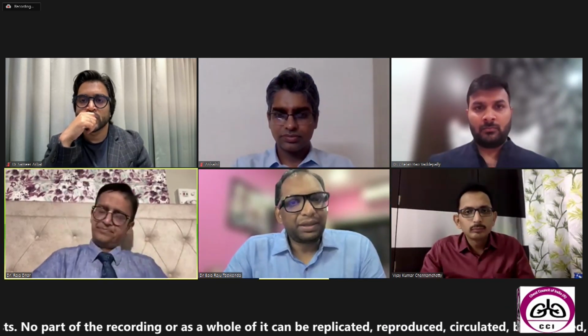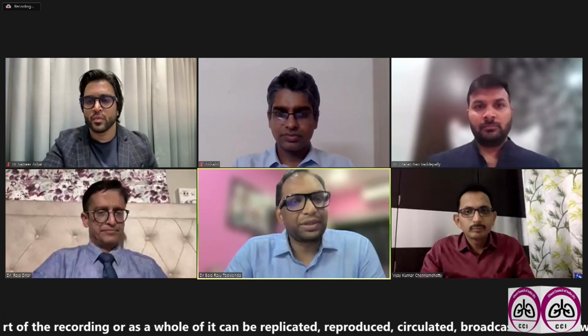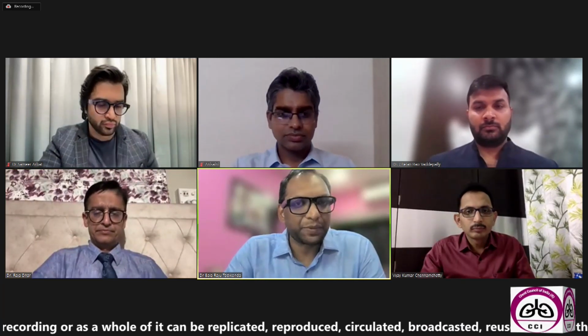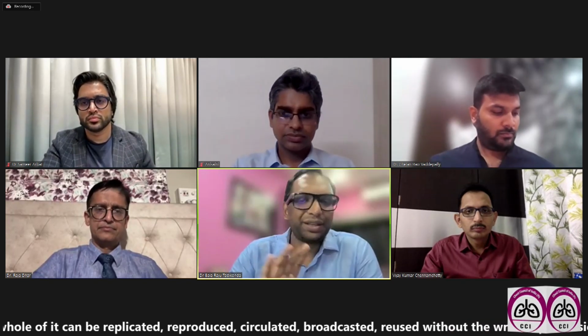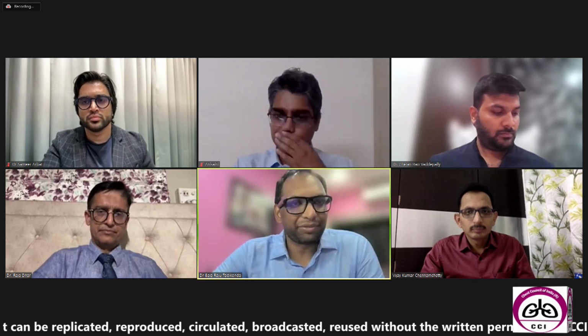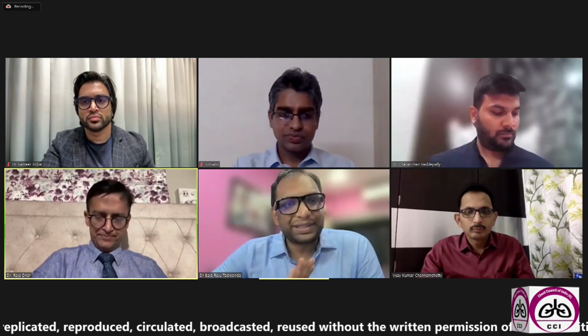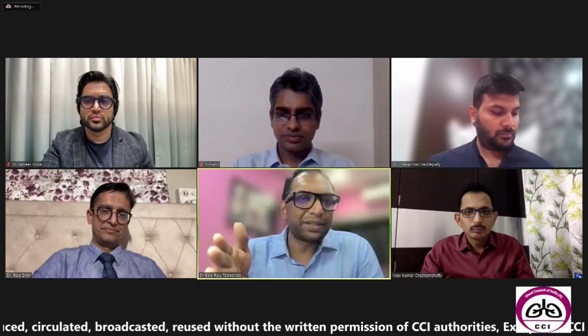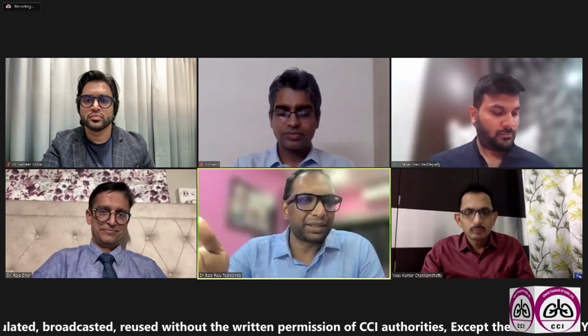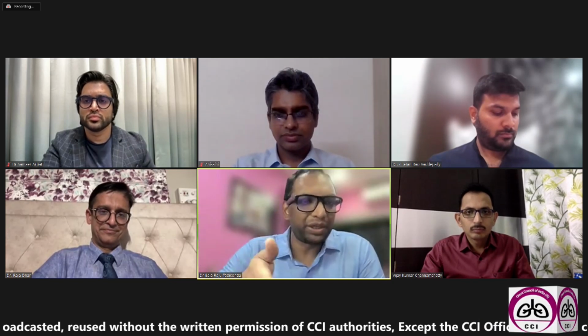First safety. For the best safety, what you can get is with the rigid bronchoscope. Once you see a torrential bleed in your life, you will not forget it. So I always feel safety is the priority. Learn your rigid skills first. Always and always, you can excel in your career. There is no point saying, today I don't do it, tomorrow I will not learn. Learn your rigid first, then you can perform your cryo lung biopsies. That's what I feel.